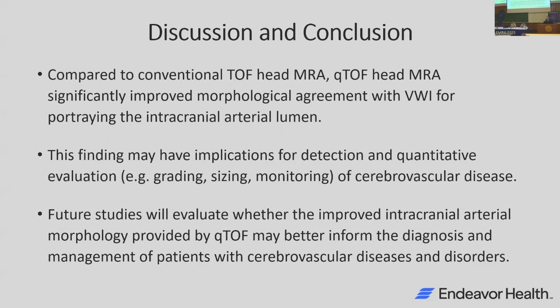Oh, right. So I want to clarify that it's not necessarily dephasing, it's just distortion of the vessel lumen. We believe it's because we're using a stack of stars-based acquisition, so there is a readout encode gradient, but there is no phase encode gradient. And these shifts are known to occur because of the time gap between the phase encode gradient and the frequency encode gradient, which we eliminate with this sequence, at least in plane. But yeah, I think more work needs to be done to look at whether we can reduce signal dephasing artifact. We haven't looked at that, but hopefully we can compare it with DSA in the future and get at that somewhat. Thanks so much for the question.